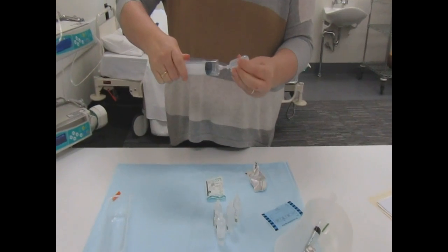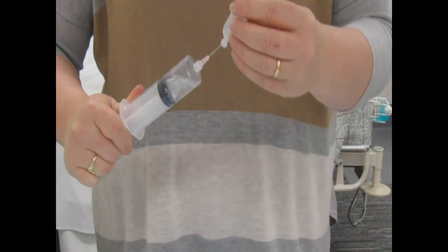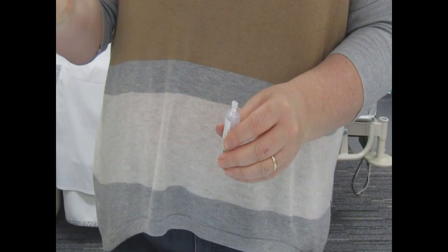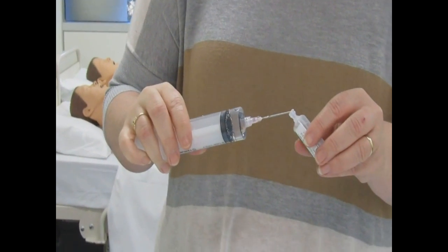Now I'll put on my drawing-up needle. For this step it's just a matter of drawing back 49.5mls of normal saline, which is nice and easy for the first few. On the last one you'll need to be very careful as you draw back that normal saline.